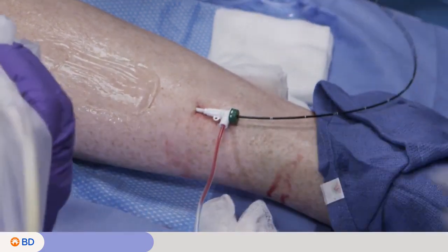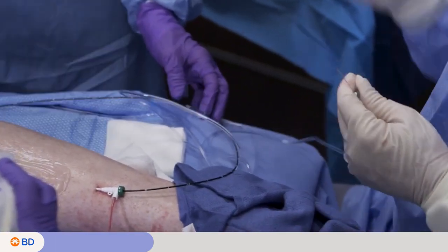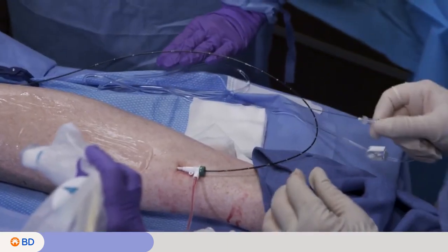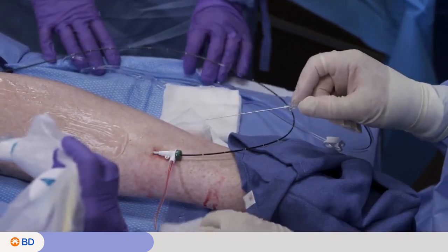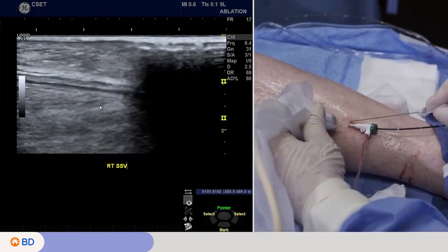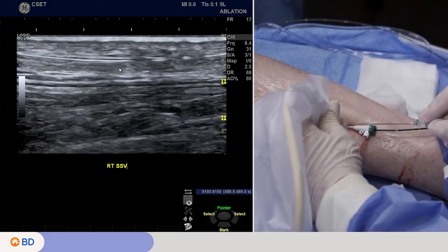The next stage is to administer the tumescence. Tumescent anesthesia is hanging in the bag on the IV pole, and this is a mixture of, for us, Ringer's lactate, epinephrine, and lidocaine. That is administered around the vein to anesthetize it and also protect it from surrounding structures. So here I come in, I'm going to enter in where it's already numb on the skin on that first wheal. I have it bevel up.